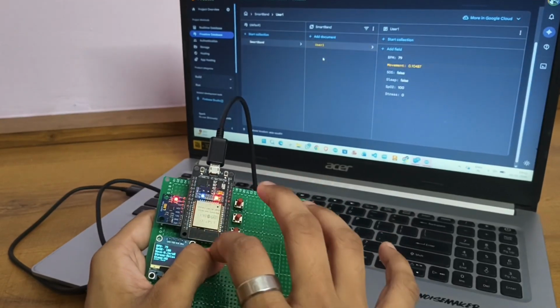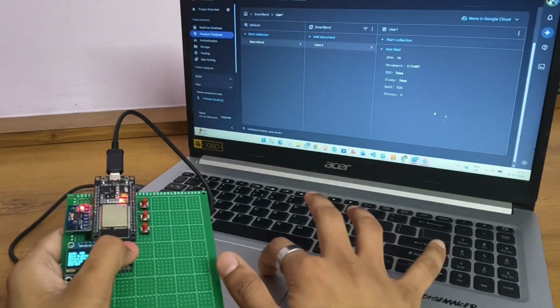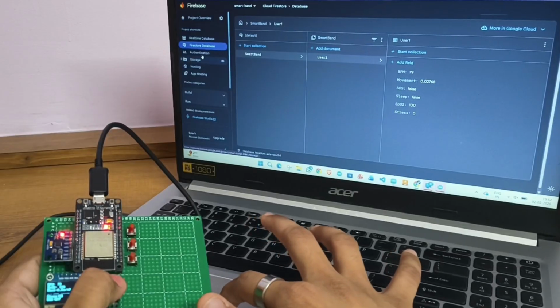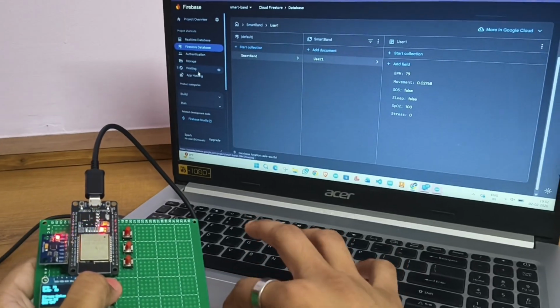This ESP sends the sensor data to the Firebase Firestore. Using this, I also hosted my website.